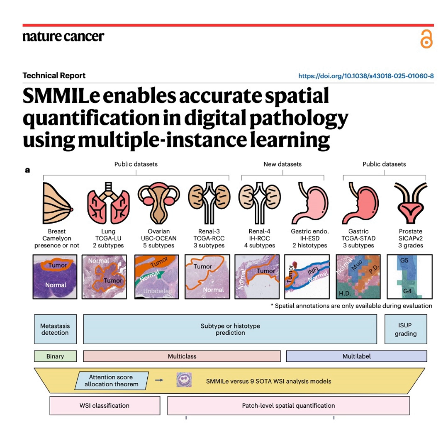But let me play devil's advocate here for a second. Go for it. ResNet-50 is a generalist. What happens when we equip all these competing AI models with the ultimate specialist lens? The researchers also tested them using Conch, a pathology-specific foundation model trained on over 1 million microscopic image caption pairs. Doesn't a rising tide lift all boats? If you give a struggling model a super smart lens, shouldn't it catch up to SMMILe?